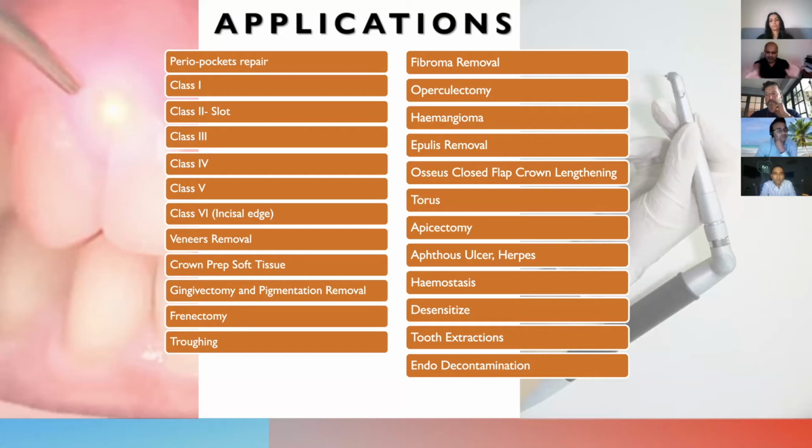So I thought I'll just give a list of things where we can use dental lasers on a day-to-day basis. Because a lot of times when I speak to colleagues, they say, is it for me? I don't do dental implants, or someone else says, I don't do orthodontics. We all have our own interests in dentistry on a day-to-day basis. So this gives you a list of things which you can do with lasers in a much better way compared to traditional ways of doing things. And the journey for the patients is so much better because of the use of dental lasers.